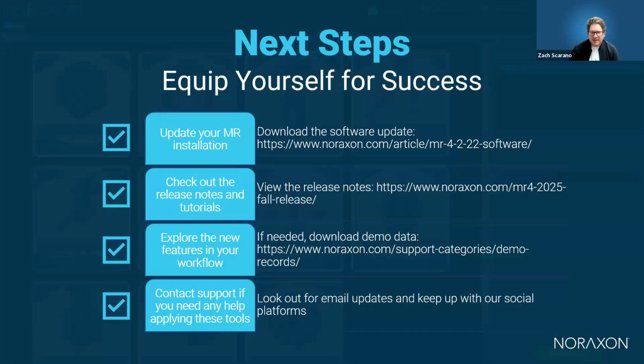Next, we definitely recommend reviewing the release notes and the tutorials. That web link would allow you to view those tutorials and explanations of the features as well, so you can learn a bit more about them. It walks through each of the features in detail and, of course, highlights the best practices for incorporating them into your workflows.